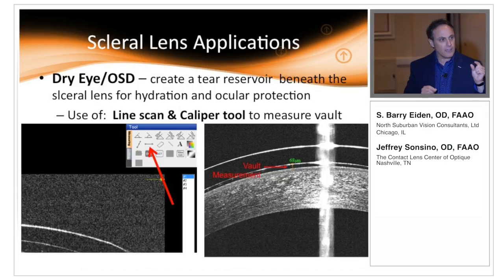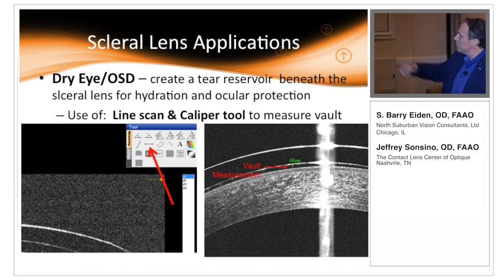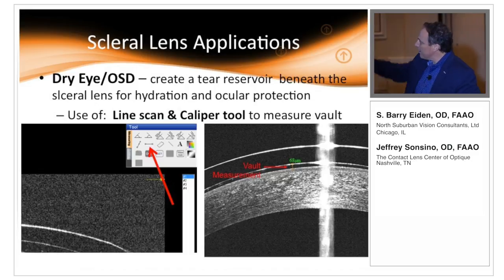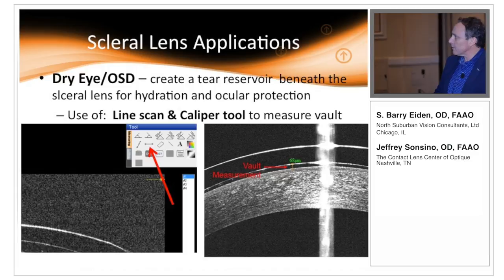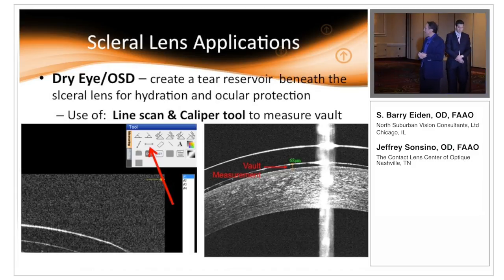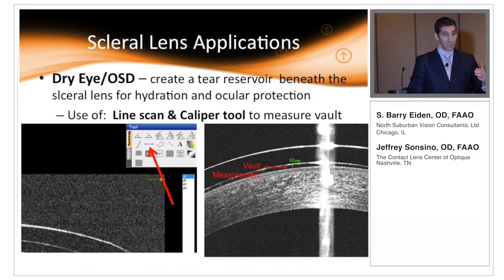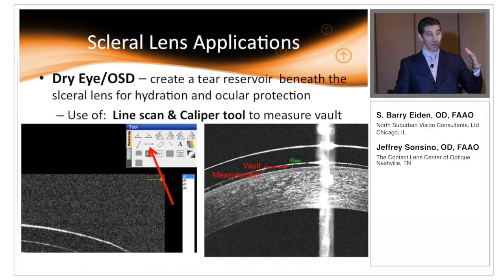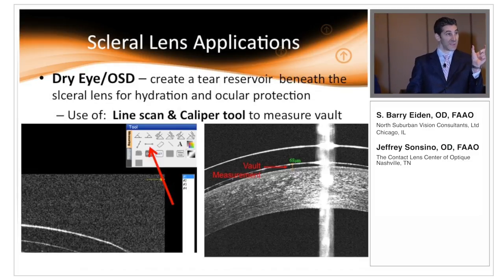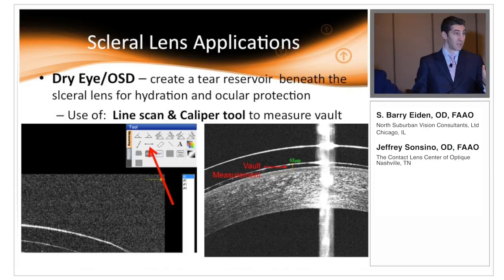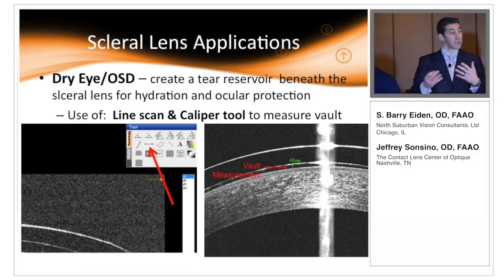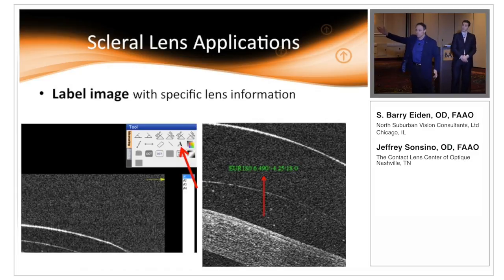Here we can see the classic measurement tool — that little line we use to measure in microns the exact vault. On the right you can see 68 microns of vault in that particular area. We use the caliper tool not only for measuring vault but also for measuring areas of bearing on the cornea — so if a scleral or hybrid lens is bearing, I measure that, and when I get the new lens I verify whether I cleared that area and am going in the right direction with parameter adjustments.